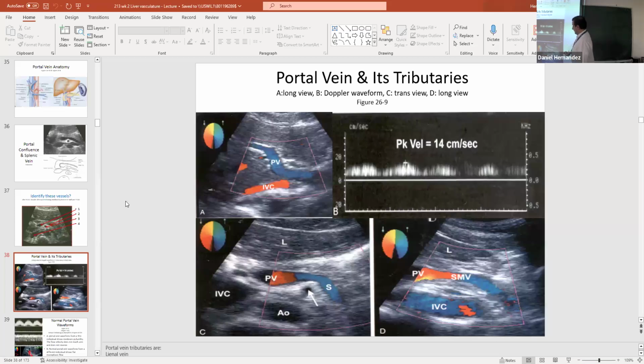I'd have to angle towards the left, towards the aorta, to see the SMA coming off the aorta. You're just in a slightly different plane. A lot of people can't even see that. Are we just literally turning the transducer?